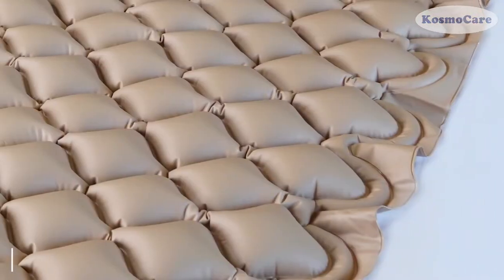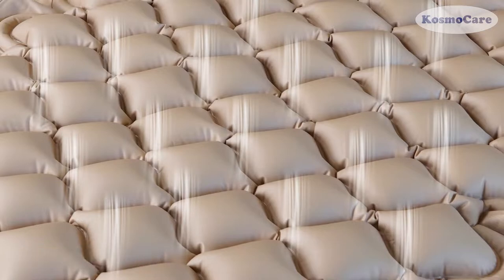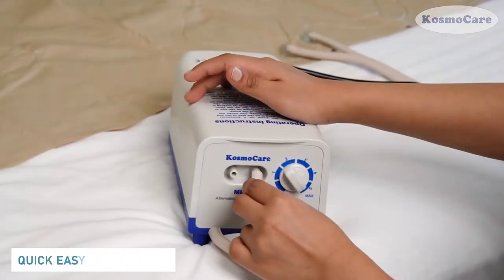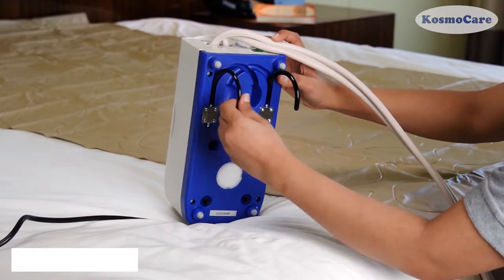The MM2 Mattress features microscopic holes which, via air loss, allow air to pass through and ventilate the patient's back for complete care and prevention of bed sores. Air hoses are flexible and non-binding for quick and easy installation. The hooked air pump of the pressure mattress can be attached to most bed frames.